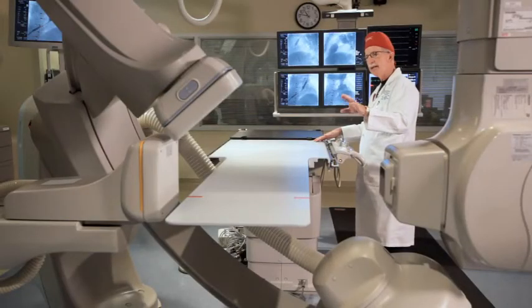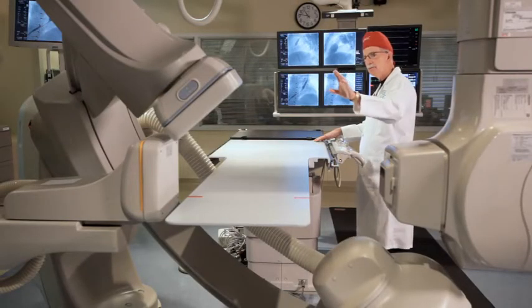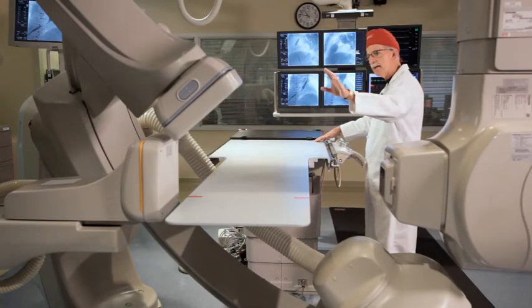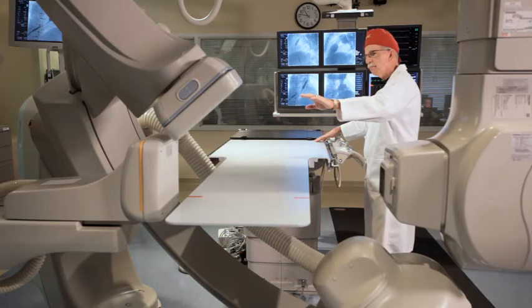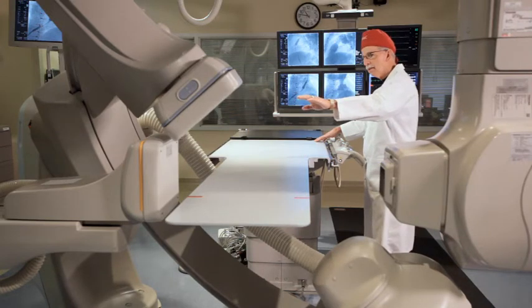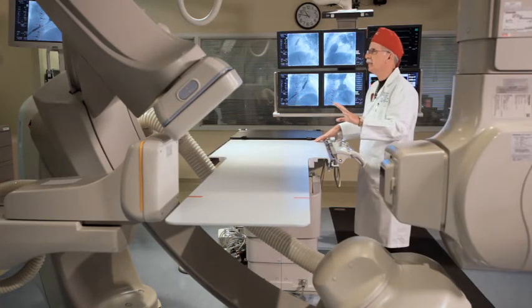One of the issues right now is that we really can't move this particular camera any closer to this camera without moving this lateral position, because they're going to run into each other. One of the problems in this particular instance is that I really need that camera to move further to the left.